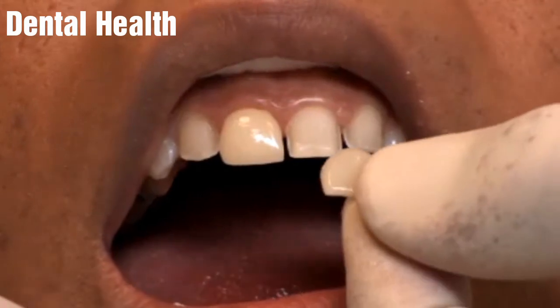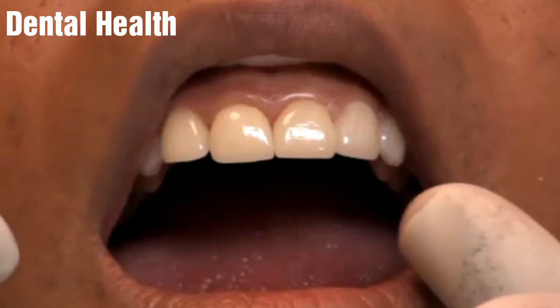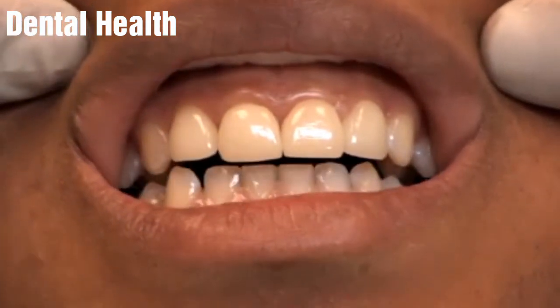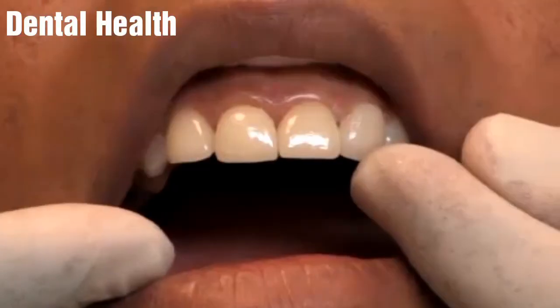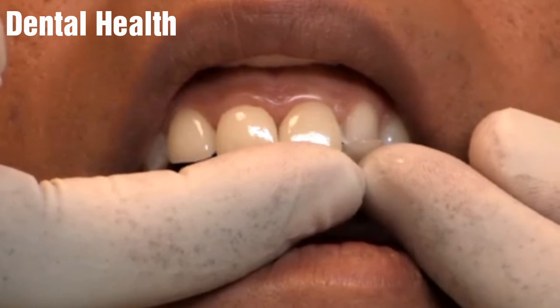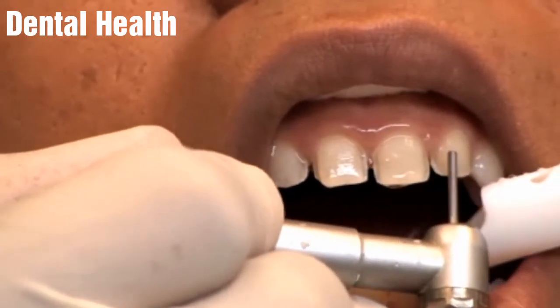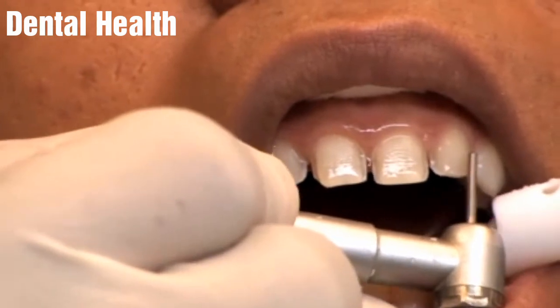In most cases, on your second visit, the veneers are placed and, if necessary, adjusted to create a proper fit. If the fit, shape, and color of the veneers are satisfactory, your dentist will proceed with permanently cementing them into place. Keep in mind, in some instances, the veneer received back from the laboratory may not fit as expected. In these cases, your dentist may have to take a second impression or readjust the tooth in order to fabricate a veneer that fits just right and creates the beautiful smile you want.